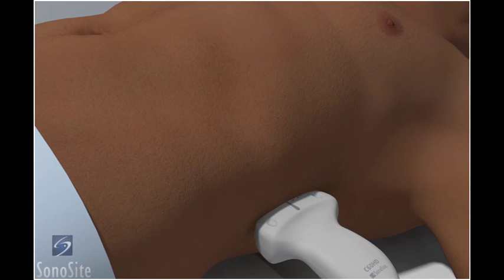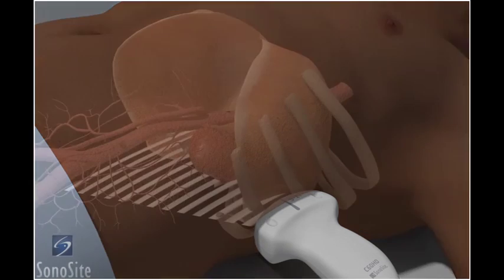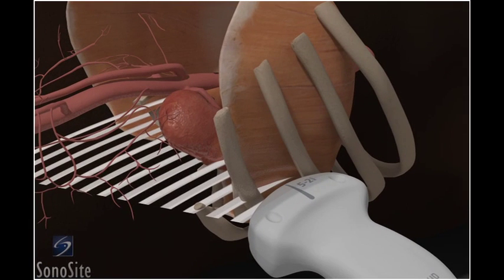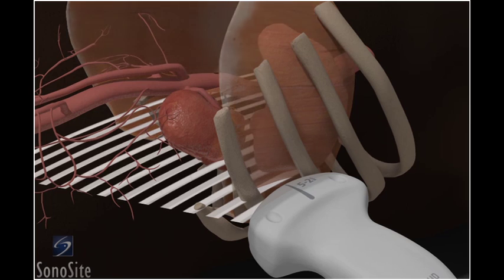Having the patient take a prolonged deep inspiration will move the diaphragm, spleen, and kidney down for easier access. The right lateral decubitus position may also be used to move obscuring artifacts from the stomach and intestine away from the kidney.